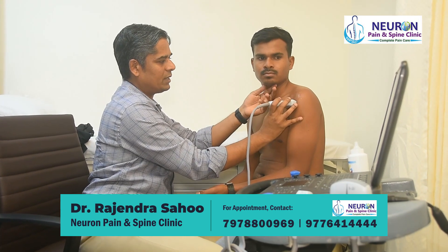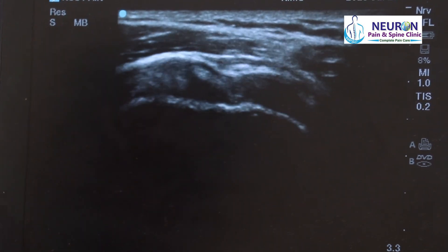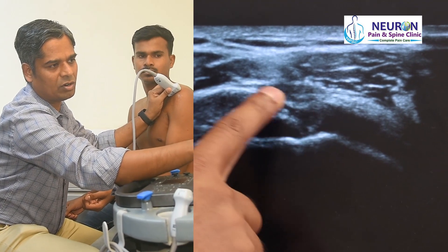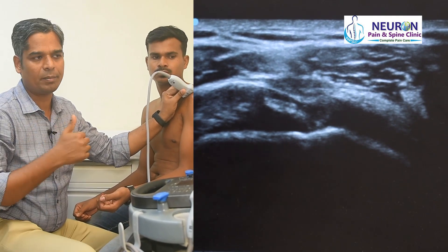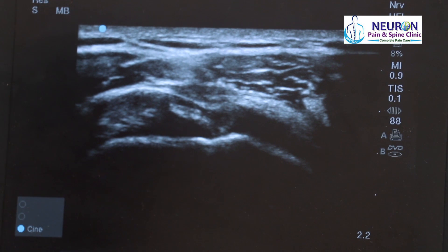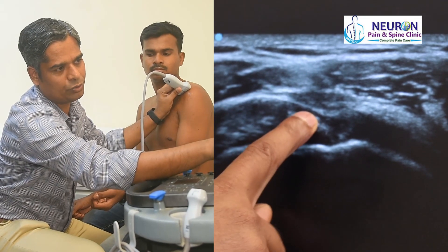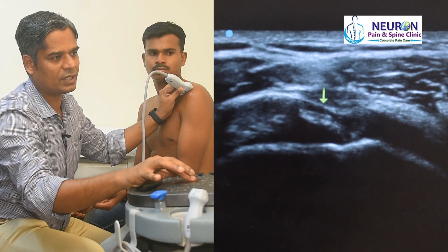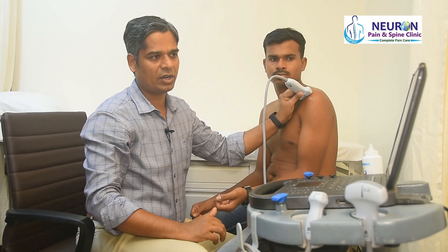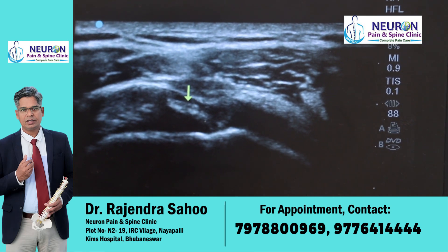In the transverse plane, I slowly move in this manner to visualize the rotator cuff interval. Here at the rotator cuff interval, that is the thumb-like sign — that's the biceps tendon. This is subscapularis and supraspinatus. The roof is formed by that hyperechoic line, the coracohumeral ligament. The floor is formed by the superior glenohumeral ligament, which is generally not feasible to see. For a rotator cuff interval injection, the needle comes from medial to lateral, piercing the coracohumeral ligament, with the needle tip just flush to the biceps tendon. The medication injected will flow into the joint.